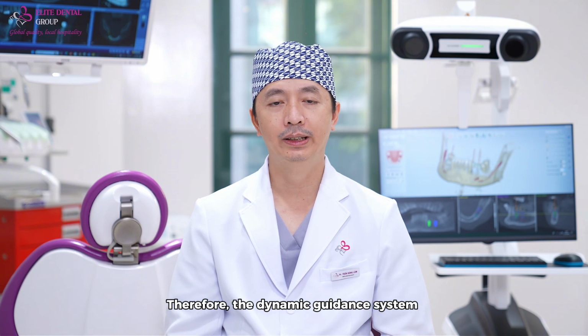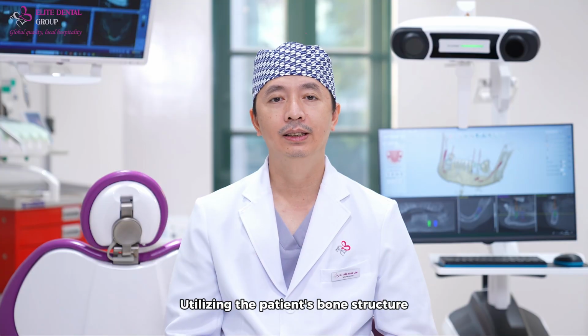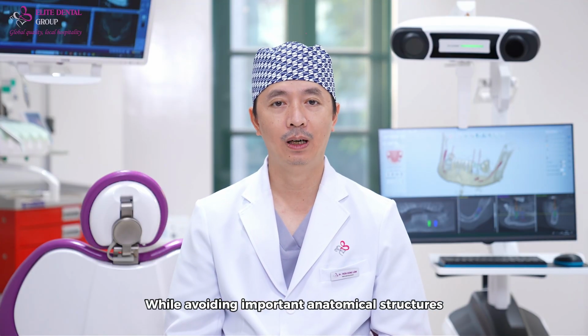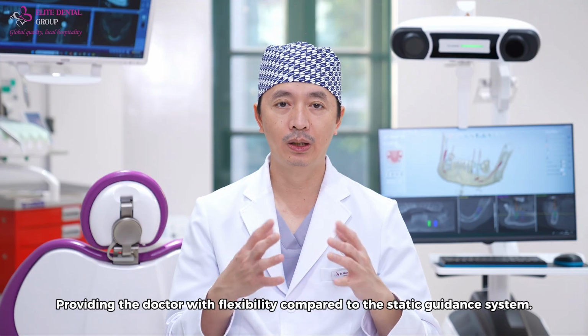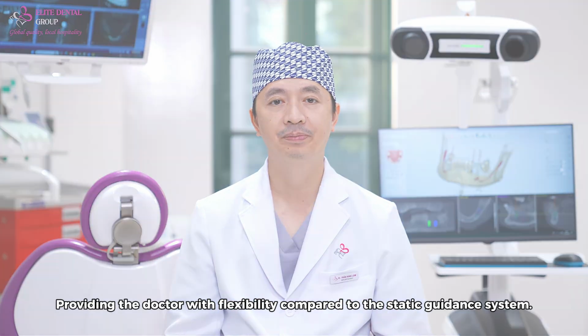Therefore, the dynamic guidance system will help the doctor place the implant very accurately, utilizing the patient's bone structure while avoiding important anatomical structures such as the maxillary sinus, nerves, or adjacent tooth roots, providing the doctor with flexibility compared to the static guidance system.